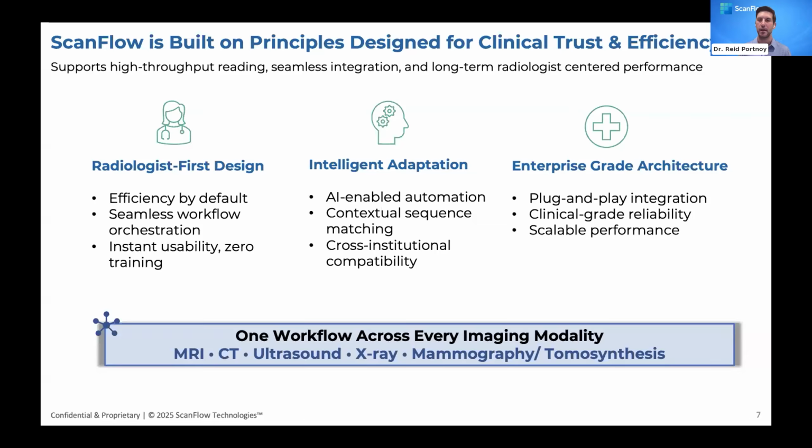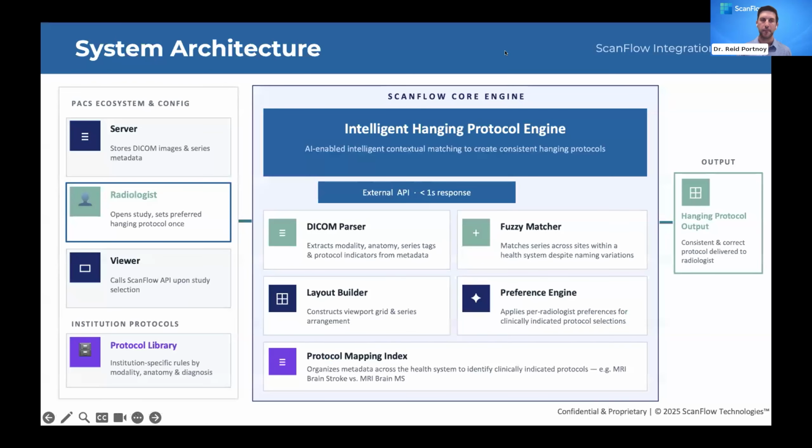And ScanFlow makes sure that that goes away, and that's solved, and radiologists can read more efficiently, no matter how many different hospitals they read from. And this helps make our product scalable.